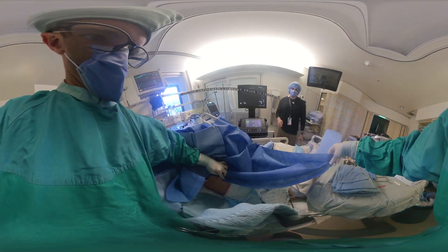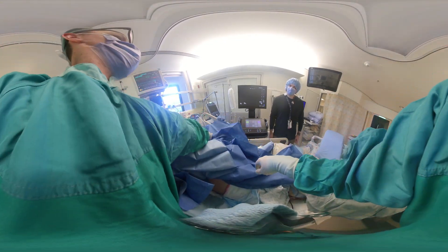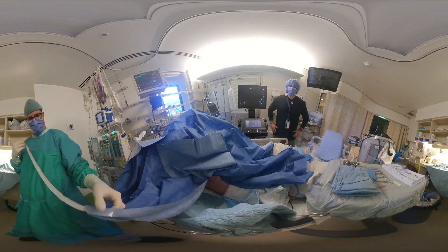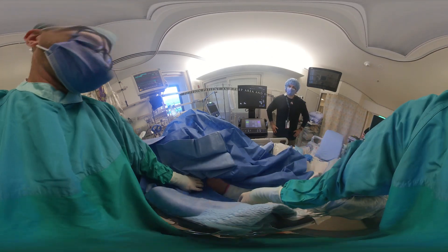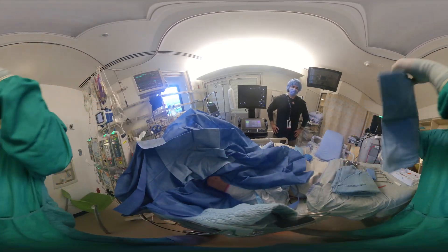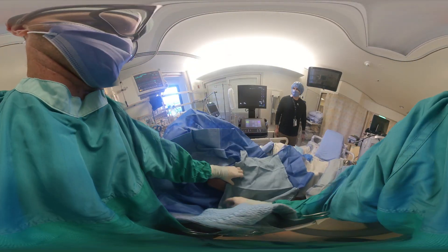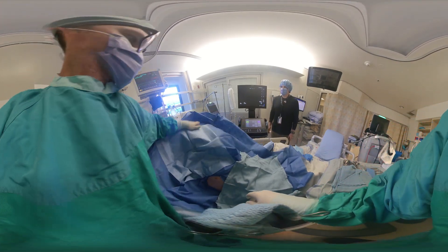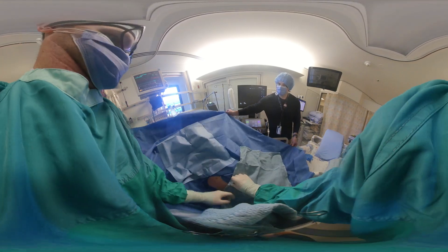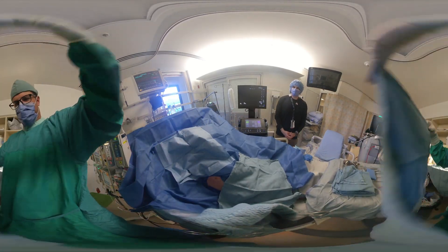We're preparing the drapes here. We did some landmarking of the chest prior to make sure we would set up the drapes appropriately. The area has been prepped and now we're just draping, making sure it's as clean as possible at our insertion site and smoothing out the drapes. This is our standard procedure in the ICU — we make sure that the whole area is prepped.